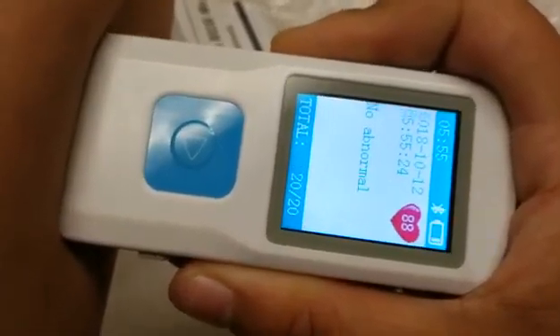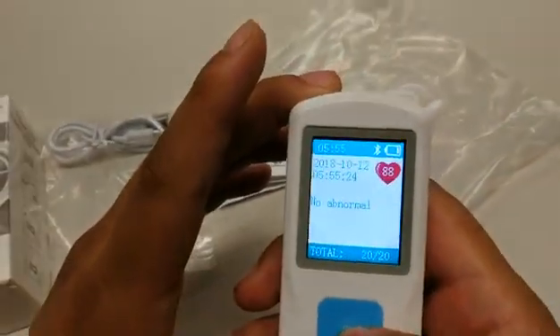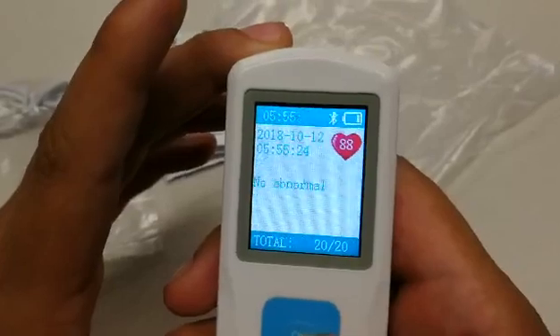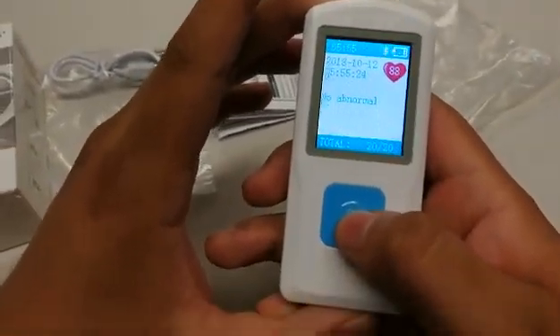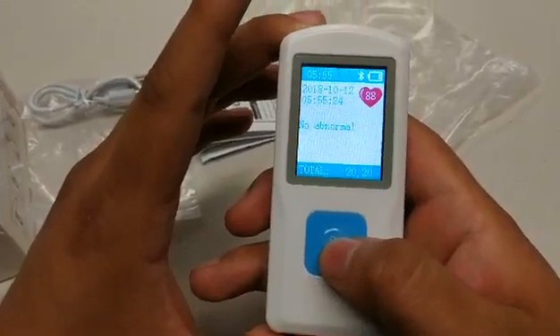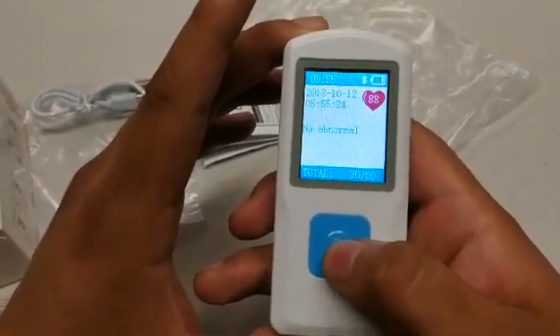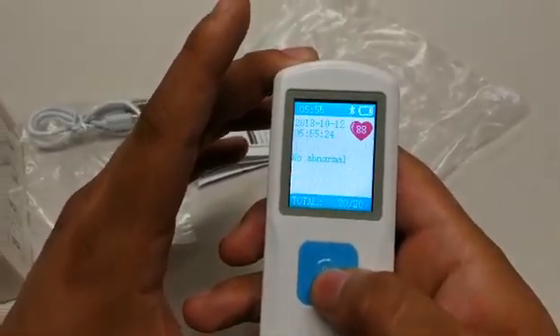As well as storing any readings in the item itself for further review, and having a Bluetooth function which can transmit data to an app available on the Play Store and iTunes Store titled PHMS.